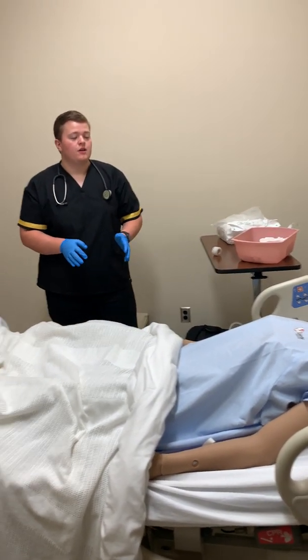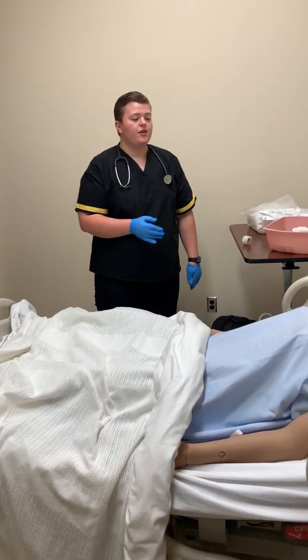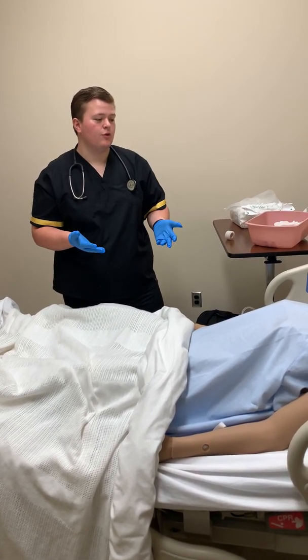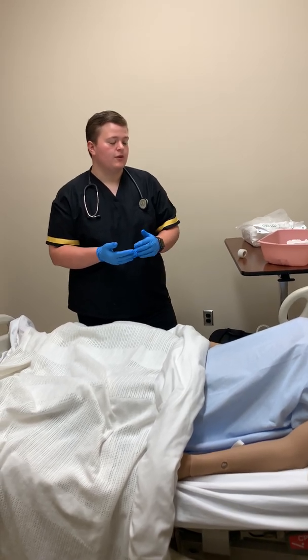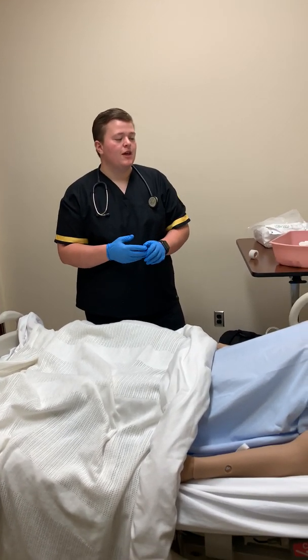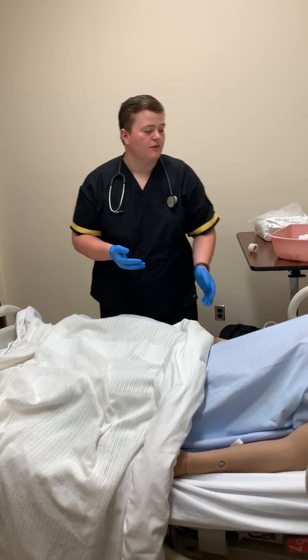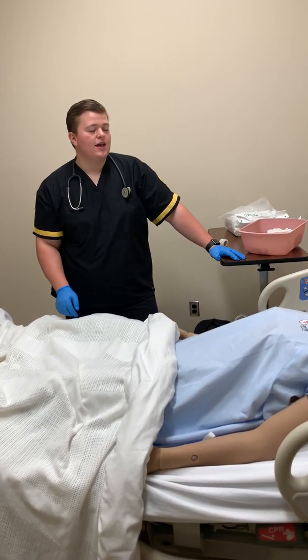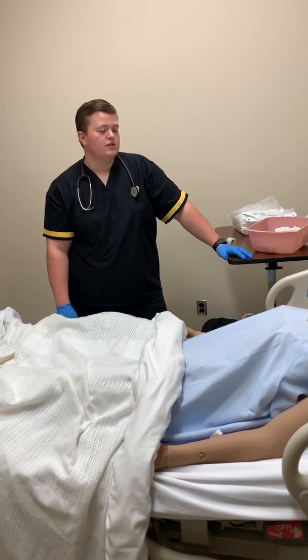So the doctor ordered me to insert a Foley catheter for you today. I don't know if you've had a procedure like this done before, but what we're basically going to do is insert a tube into your urethra down to the bladder. It's going to drain some of that urine and allow us to collect samples. Before we get started, do you have any latex or iodine allergies?